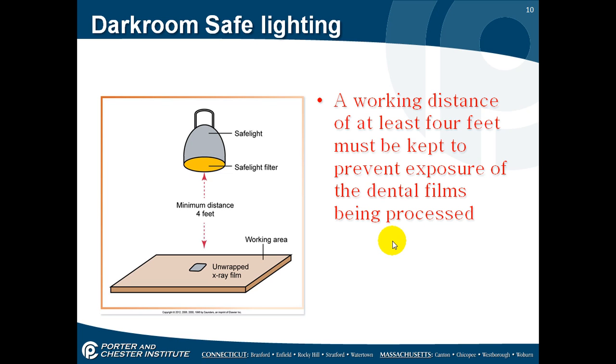The working distance has to be at least 4 feet from it to prevent any exposure even from that light. If that safety light is too close, you can get some exposure to your film.